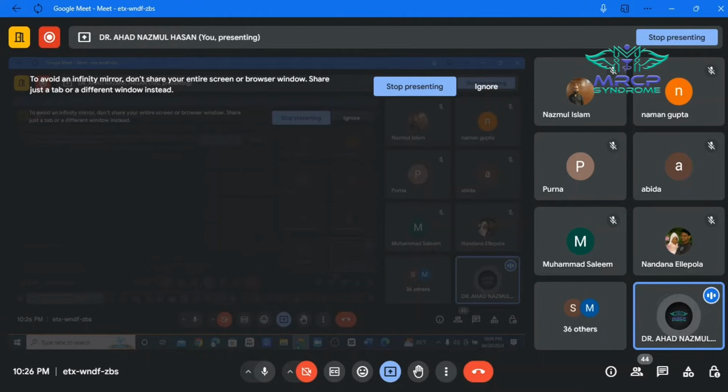Repetition time is the amount of time between the successive pulse sequences applied to the same slice, and TE is the time to echo. TE is the time between the delivery of the radio frequency pulse and the receipt of the echo signal. So depending on the duration of TR and TE, the T1, T2, FLAIR types of images are obtained.